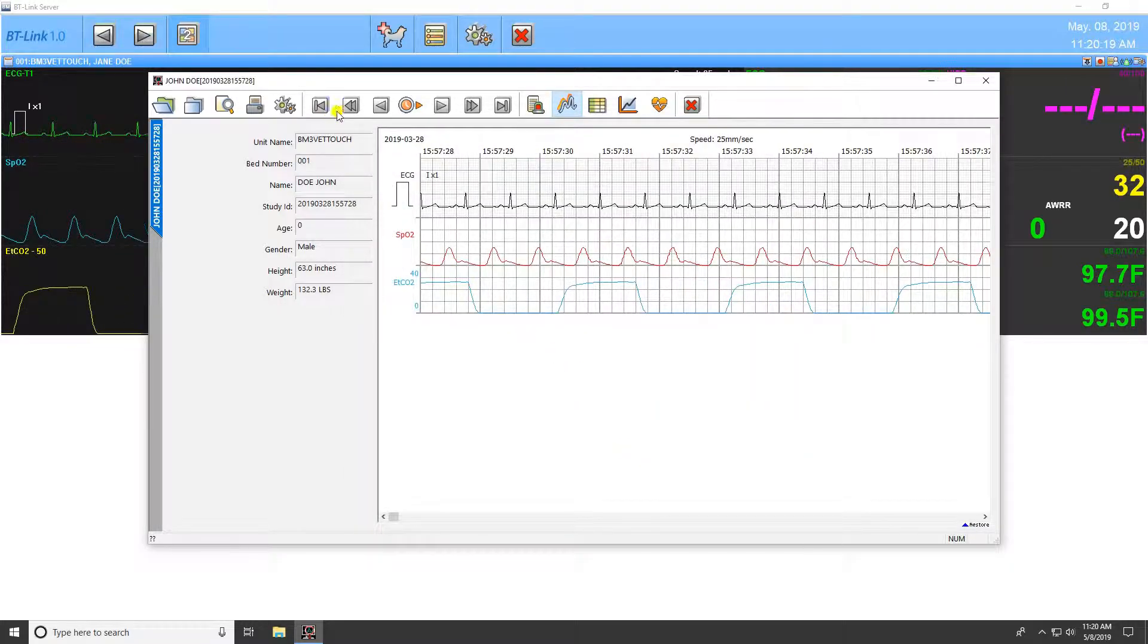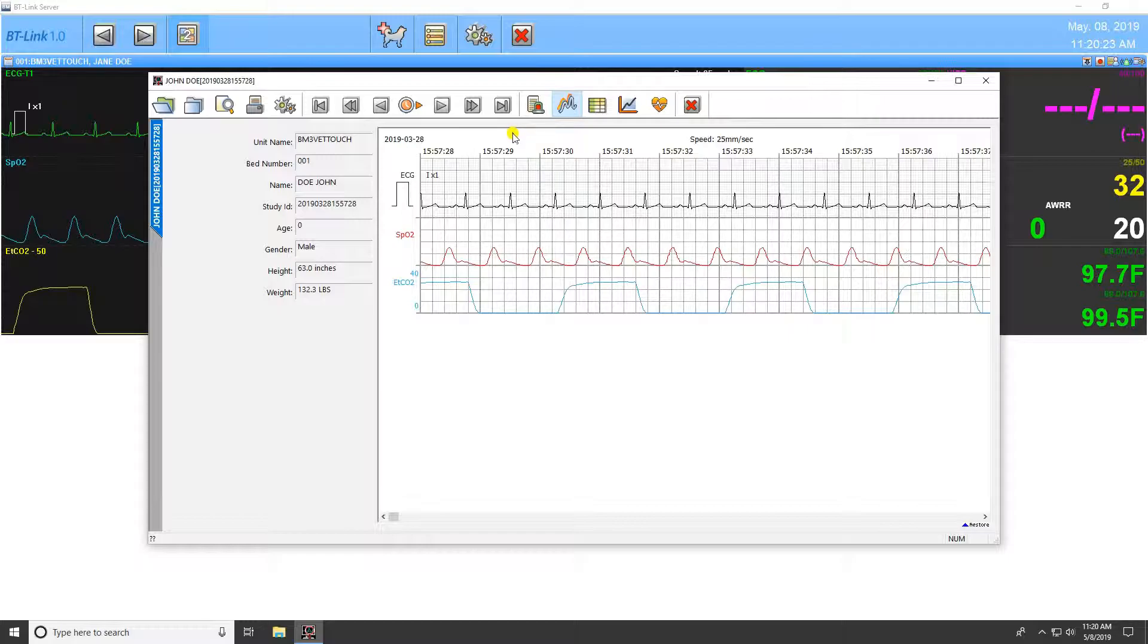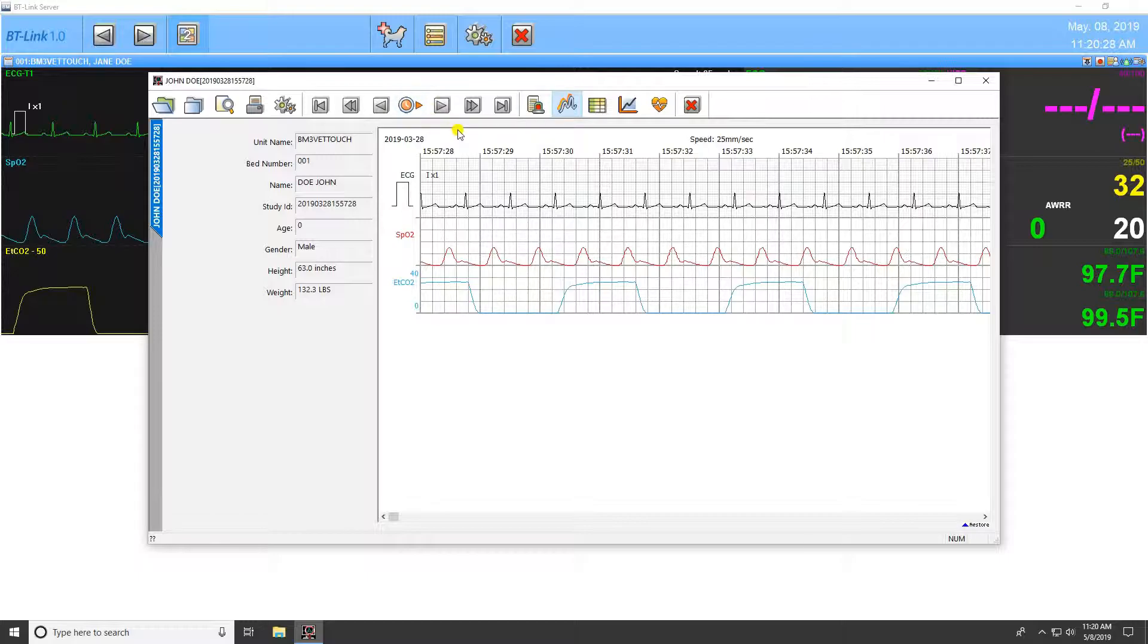The next seven icons allow you to adjust the position of the currently selected study. You can go to the beginning or end, page forward or back, and decide which specific point you would like to start from.